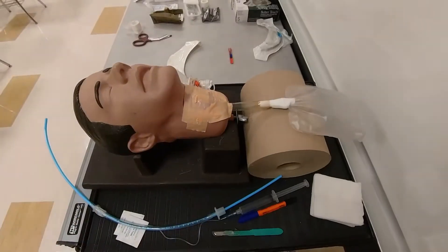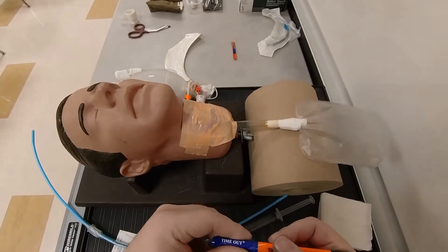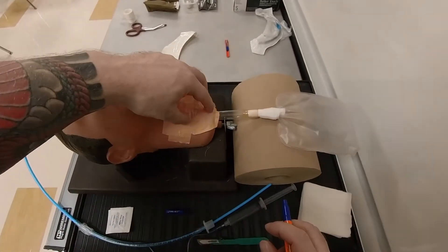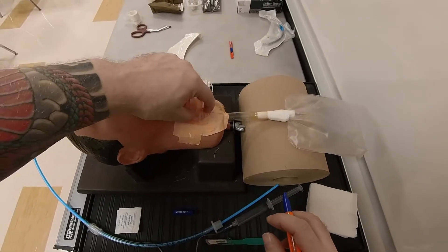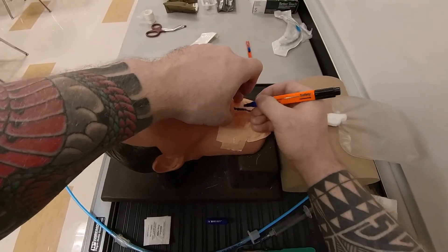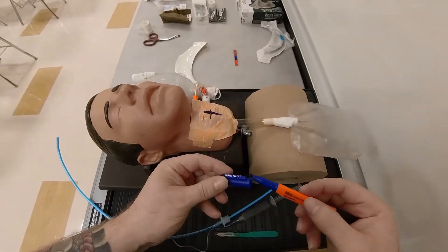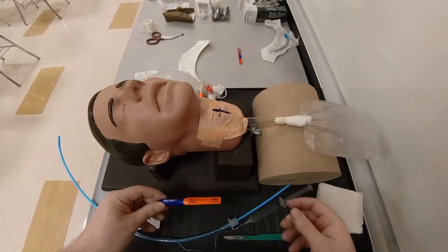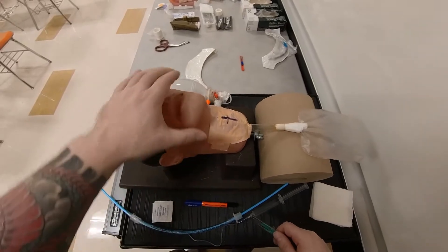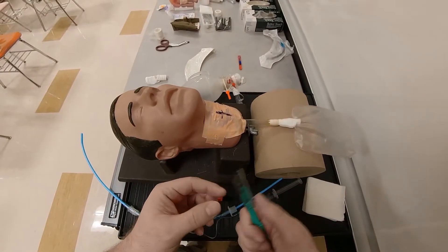Come to the patient. You're going to be standing at the patient's right side if you're right-hand dominant. Find your landmarks — we've already used betadine or chlorhexidine to cleanse and prepare the site. Go down from the sternal notch, feel your rings — this is your cricoid cartilage. Feel the prominence — this is your thyroid cartilage — and here is your cricothyroid membrane. Make your mark here. Once you've made your mark and know your location, you must wear full PPE: face protection and eye protection, because the moment you make your incision and gain access, you will get splattered in the face.